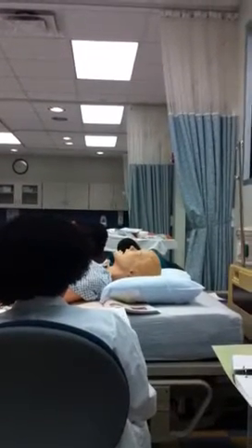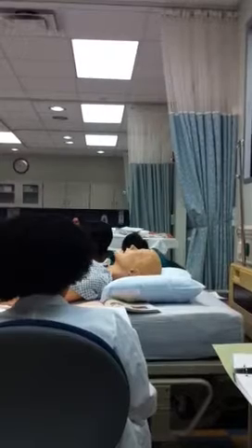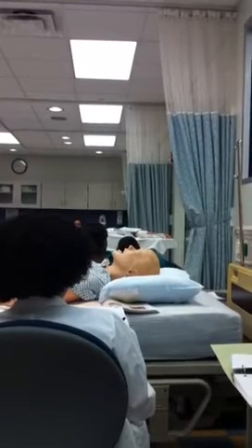Okay. I'm going to pretend this is my insulin. Whoever that is, don't turn it off, please.